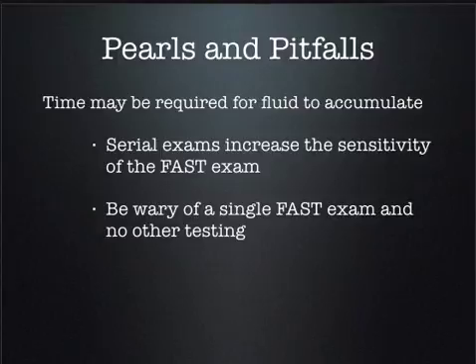So just some pearls, and we're almost done. Remember, if you're going to do one FAST exam, if you're not going to do a CT, you should probably do another one, because remember, it takes time for blood to collect. So try and do 2 FAST exams if you're not going to do a FAST exam and a CT scan.